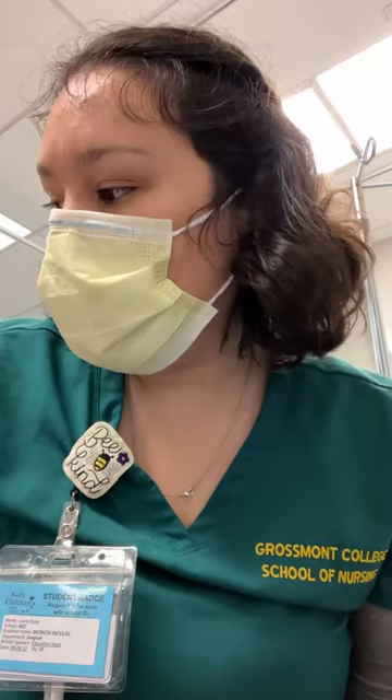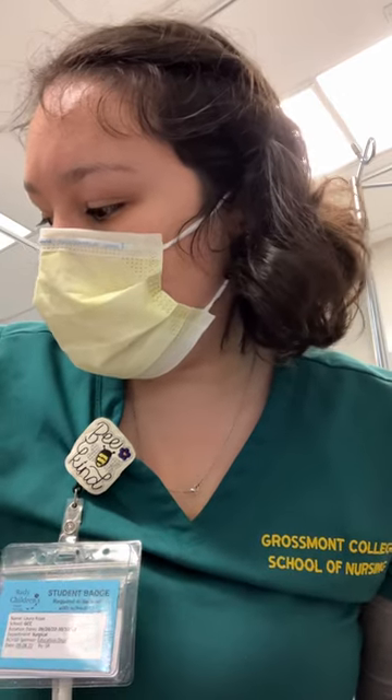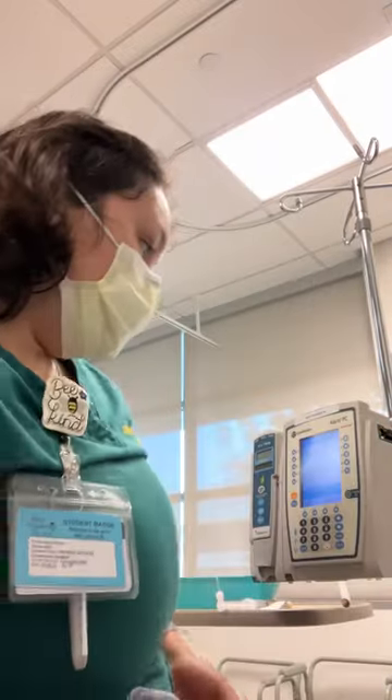Hi, my name is Laura. I'm doing an IV primary and IV piggyback. I did my first and second check in the med room and made sure that my piggyback is compatible with my primary. I have ciprofloxacin and normal saline and they are compatible. I'm going to do my third check in the patient's room.